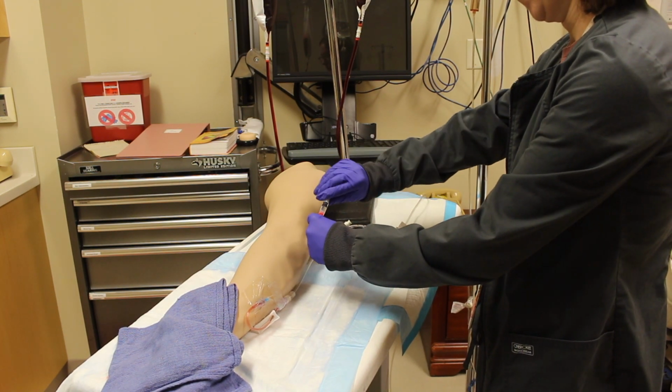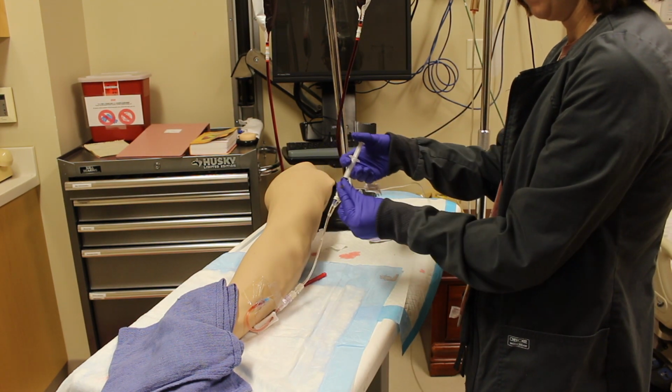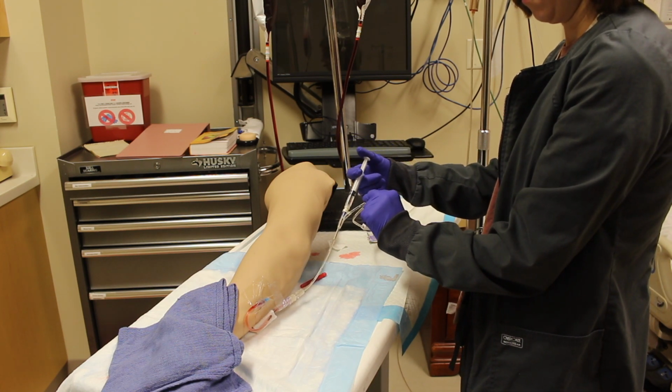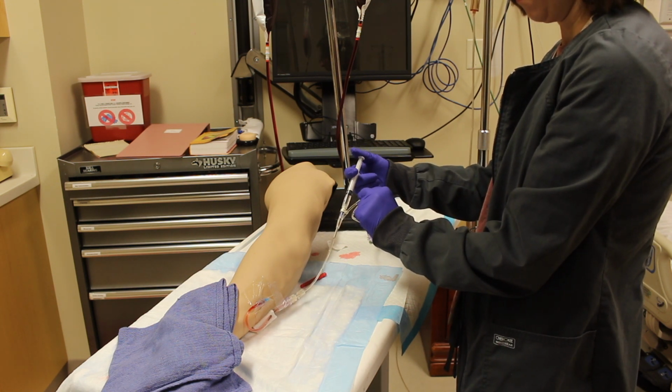Insert the medication syringe into the injection port. Pinch or clamp the IV tubing between the IV bag and the port. If needed, depending on your connection device, gently aspirate for blood return. Most of the connection devices that we have currently do not require this.